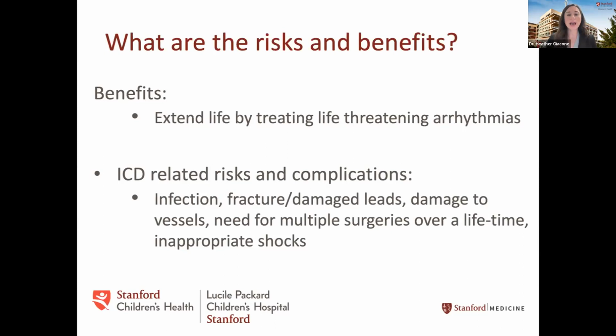But let's talk a little bit now about ICD-related risks and complications. In any type of procedure, you can have an infection. Over time, there's concern about fracturing or damaging the leads that might need to be replaced.